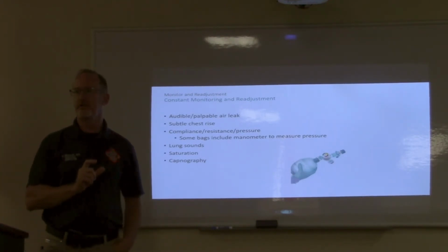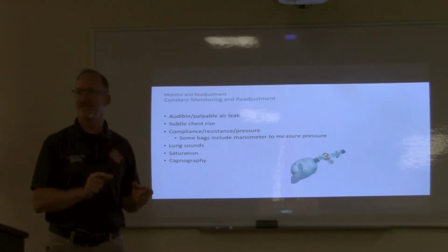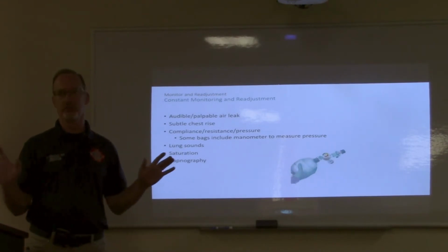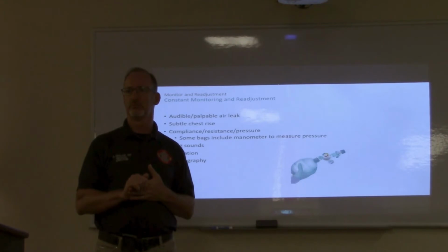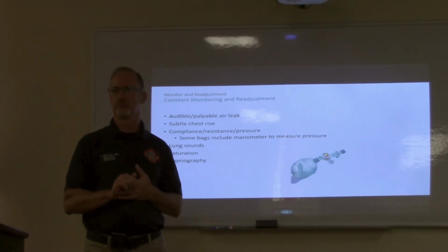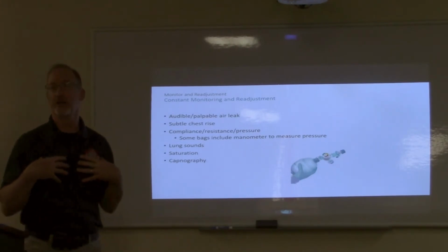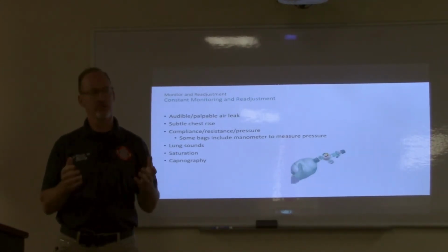What information can we get from capnography that would make it worth doing that every time? Not a code. How their breathing is, and if anything is going on, you can tell from capnography. Okay, so like you could tell if they had some obstruction. Good exchange.